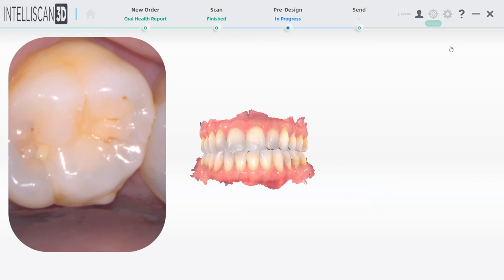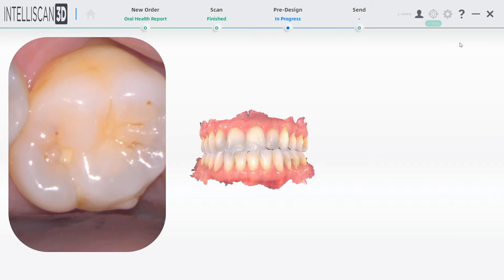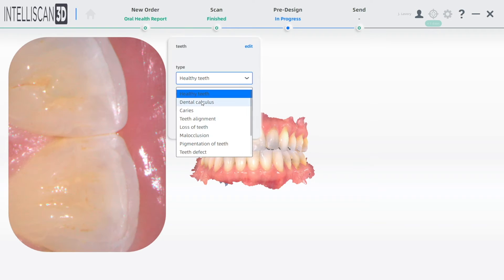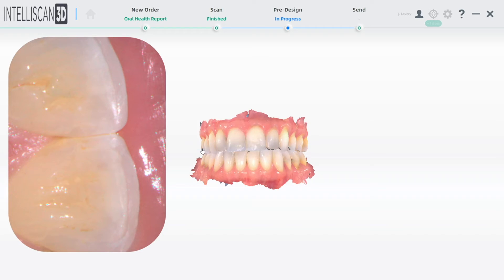When using this mode, it turns your IntelliScan Model X scanner into an intraoral camera. When you or your hygienist are discussing possible solutions with your patient, you can take a photo of the area needing service, making any notes that you can while you're talking to the patient.